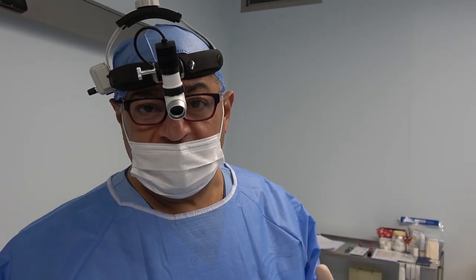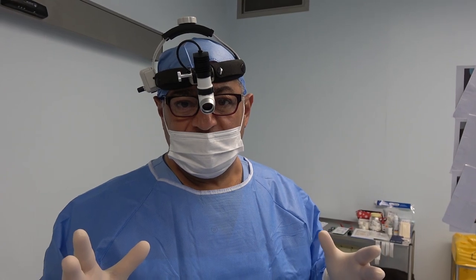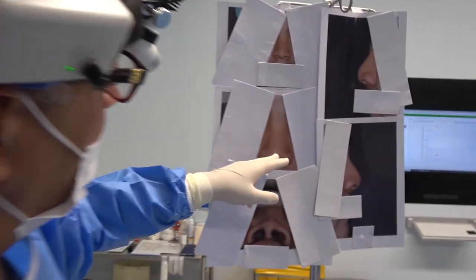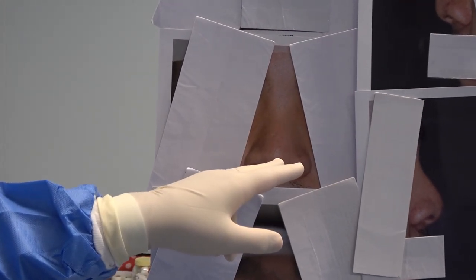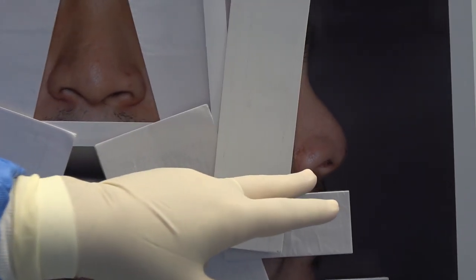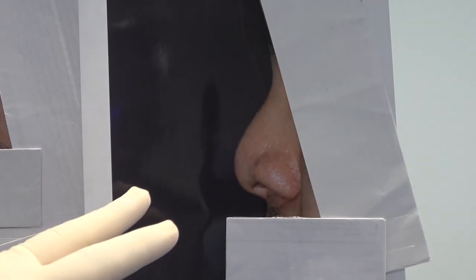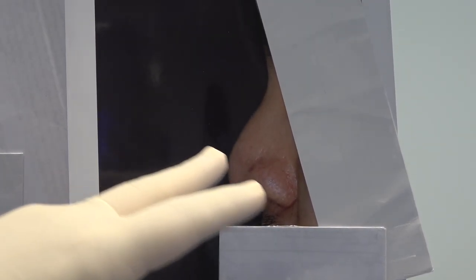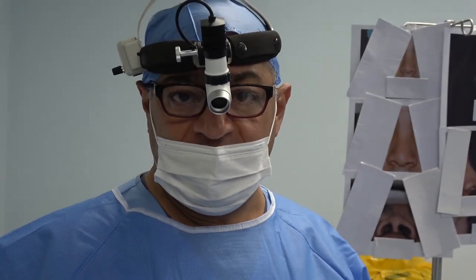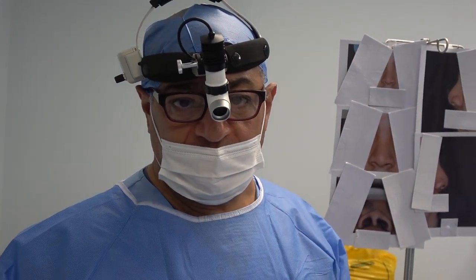A case of Chinese Southeast Asian nose. As you see, wide, round, broad tip, very wide alar base, under-projected tip, low radix, low dorsum, short dorsum. So we are going to do an augmentation rhinoplasty. I hope you enjoy the procedure.